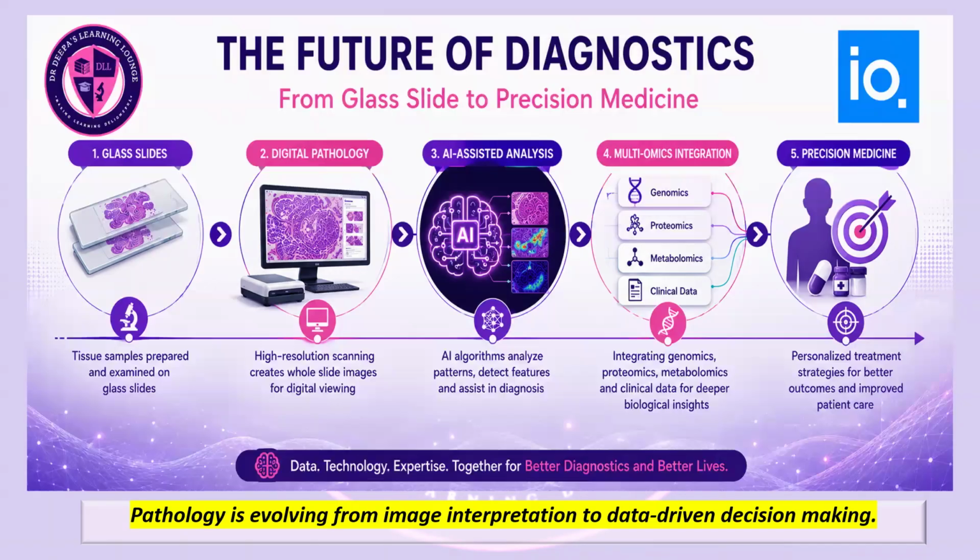I have closely worked with a couple of patients with a skin disorder here, which was doubtful to be a malignant melanoma. It was not clearly a malignant melanoma, but I had the whole slide image of the same. I had a second opinion booked for the patient by a very famous dermatopathologist in the US whom I work closely with. I could do that because it was a whole slide image. Do you think it's actually possible to pick up a glass slide and pray to God that it doesn't break by the time it reaches the US? And how long does it take? This takes a jiffy. I email him, I'm done. But if I want the same thing to be done by the conventional method, it's nearly impossible. So that is where it forms a change.